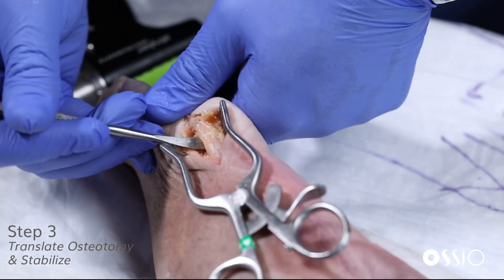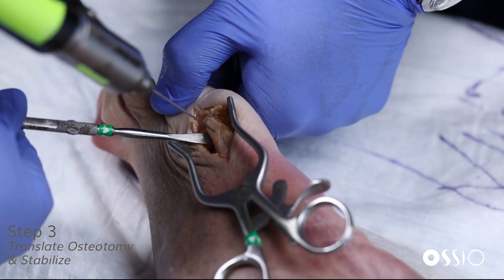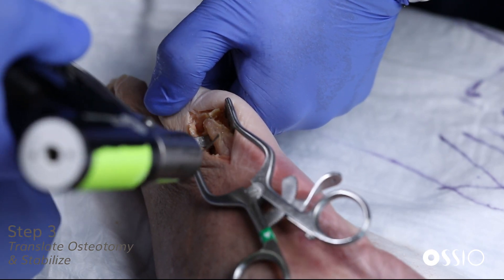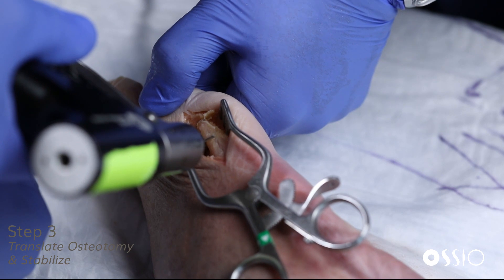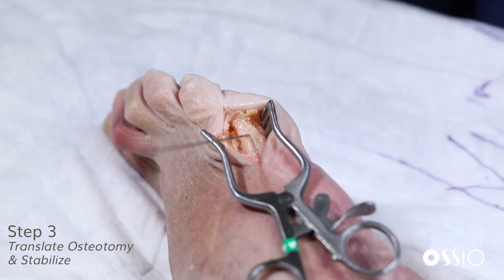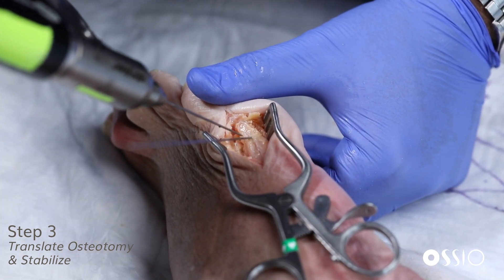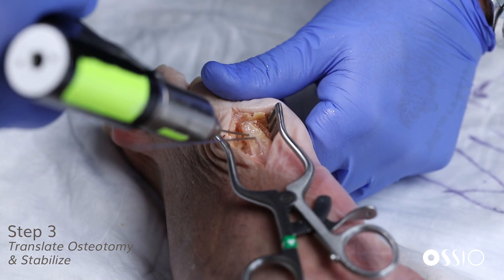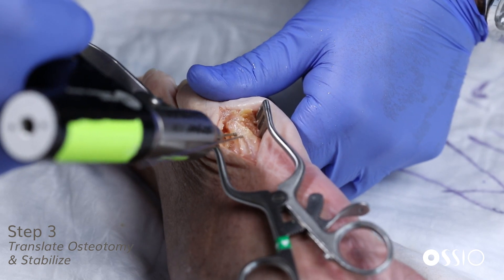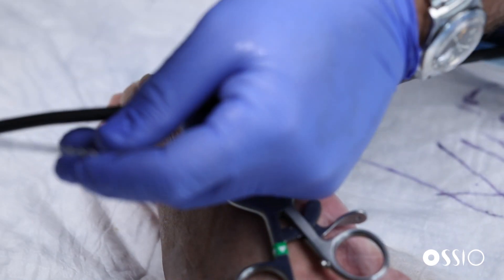Here we translate the metatarsal head more medially. You can use a Hohmann or other device to help with that. The two included 1.1 K-wires from the disposable set are inserted. This adds bone stability from the translated osteotomy and can serve as pilot holes for our proposed Osseofiber nails — either as temporary fixation for additional control, or if you decide to place two implants, you can use both as pilot holes.